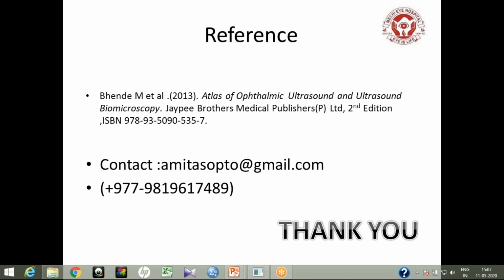So we have to comment about the globe size. It gives a gross idea about the actual length. And if you do the scan under anesthesia, then it will be better.